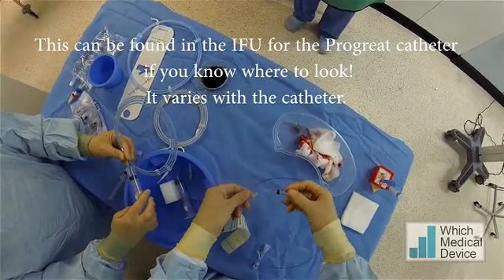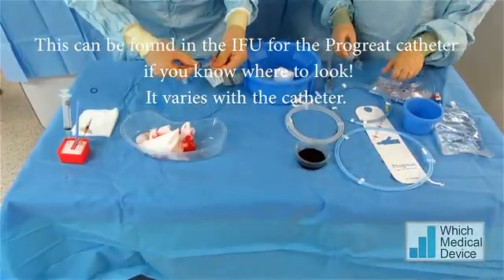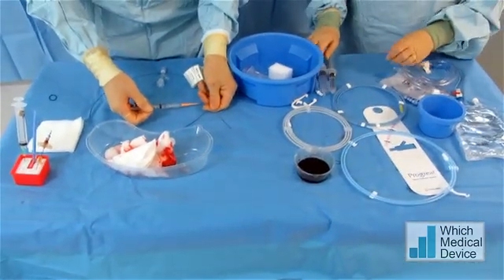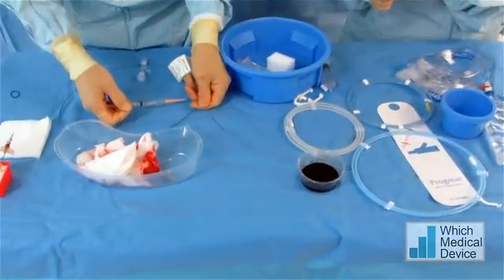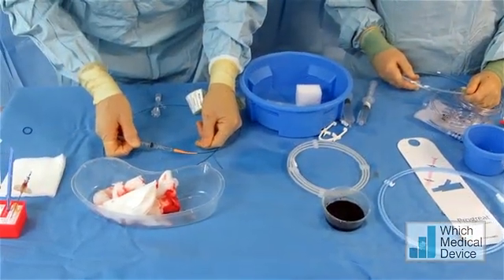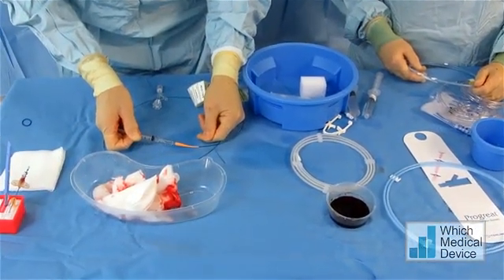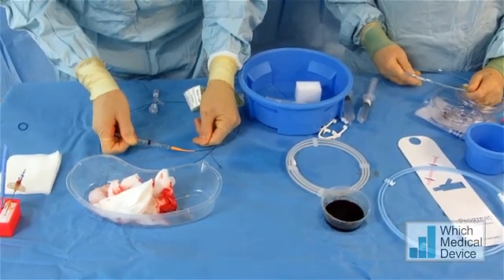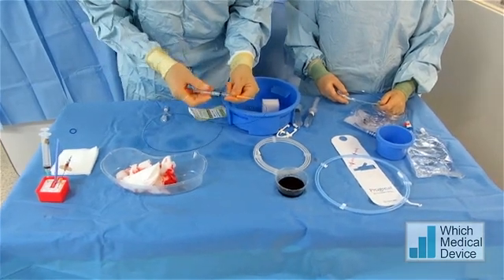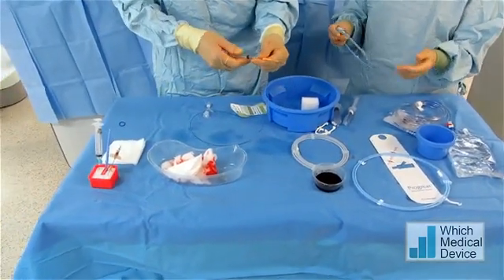I've got a syringe with 1 ml of saline, and I'm just going to slowly inject the saline and see when it comes out the other end - that'll give me the dead space. So including the hub, that's about 0.4 of a ml dead space. That's what we need.